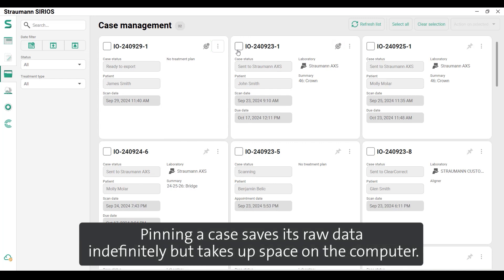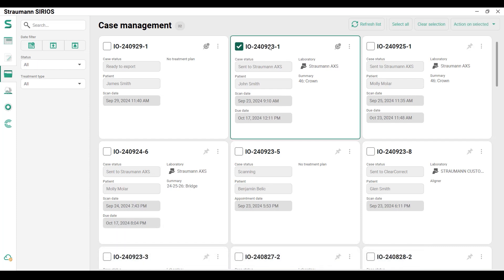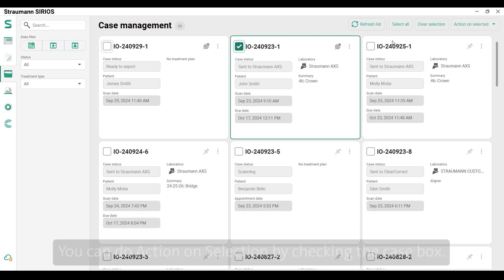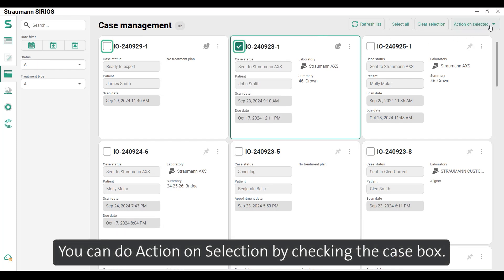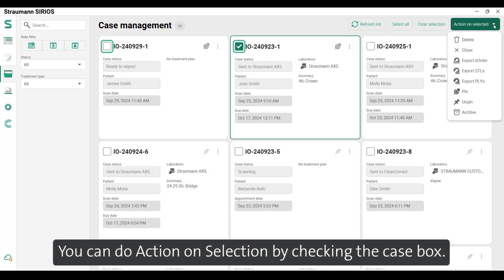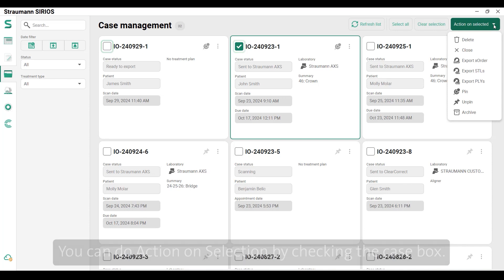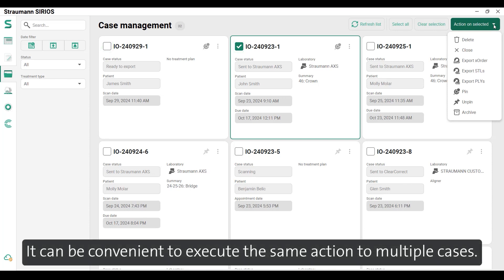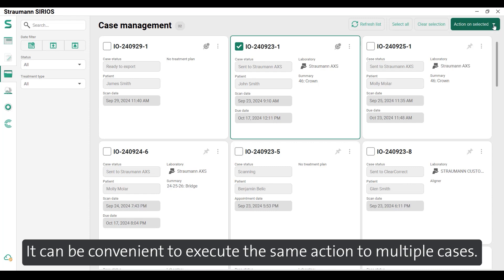To keep the raw scan file, use the PIN function. Pinning a case saves its raw data indefinitely but takes up space on the computer. You can do actions on a selection by checking the case box — this is convenient to execute the same action on multiple cases.